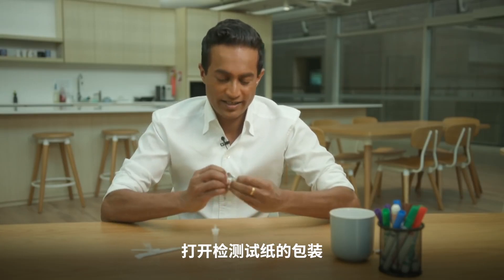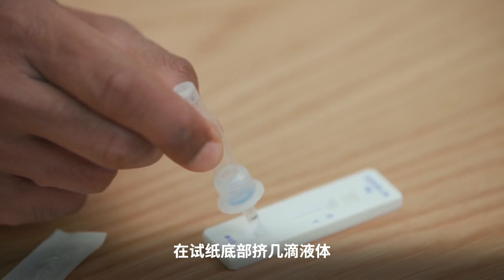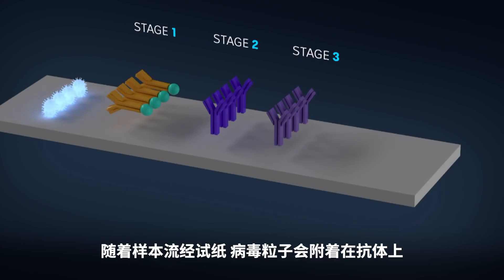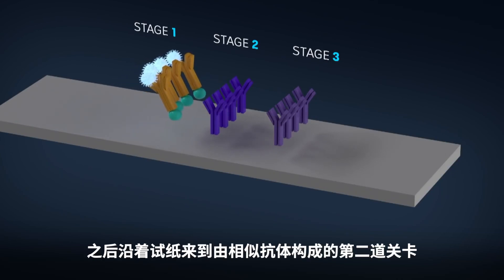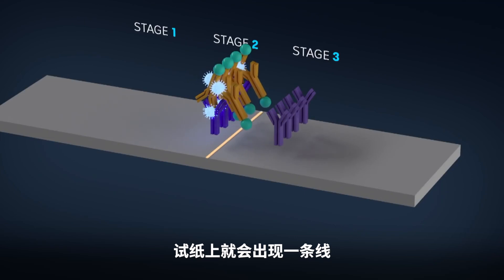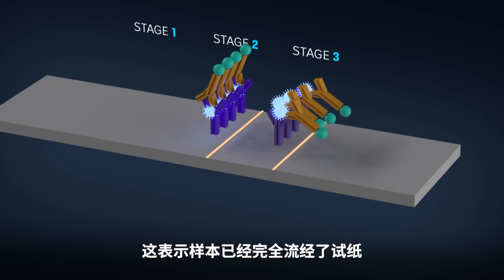Then unpack your testing strip and squeeze a few drops onto the bottom of it. This next part might remind you of how a pregnancy test works. The strip has three stages that the sample passes through. The first stage is made of antibodies sitting on the testing strip — as the sample moves down the strip, any virus particles bind to those antibodies. Next along the strip, a second line made of similar antibodies that are stuck hard to the paper. If the virus is present in the sample, the two will bind together and a line will appear on the strip. The third line is a control strip — the antibodies will bind to this line no matter what, indicating the sample has made it all the way across the strip and the test has run correctly.